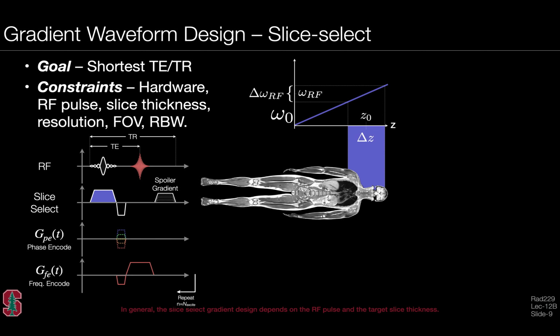You'll recall from earlier lectures that the excitation frequency that we use in our RF pulse will determine the range of spatial positions that are excited by the exciting pulse, scaled according to the applied gradient strength. And so the applied gradient is demonstrated by this purple line here, which linearly relates the excitation frequencies to the positions that would be excited.